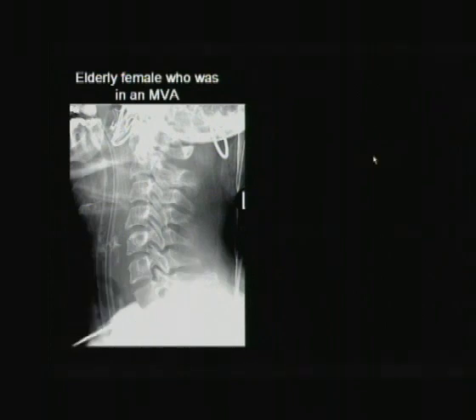And then there's a faint calcification here that we explored a little more by looking at soft tissue windows. And obviously, this is a calcification that we sometimes see in elderly people with CPPD. So with one test, we saw 3 diseases. And I think this is great for one test. Here you see this clump of calcification posterior to the dens and the fusion of the occiput to C1. And on the axial, you saw the Jefferson fracture.